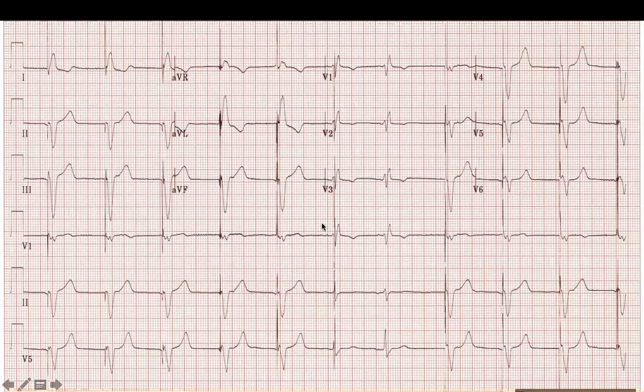If we're not really sure, look at the other rhythm strips. In V1 this looks like this one, maybe the R is a little bit smaller. Go up to V3, V2, V1, the same morphology. Look, here there is a pacer spike, but this is not giving you the paced morphology, it's giving you the intrinsic morphology.